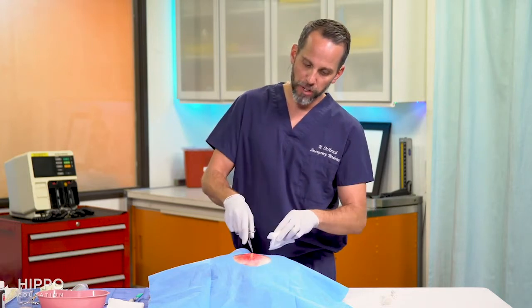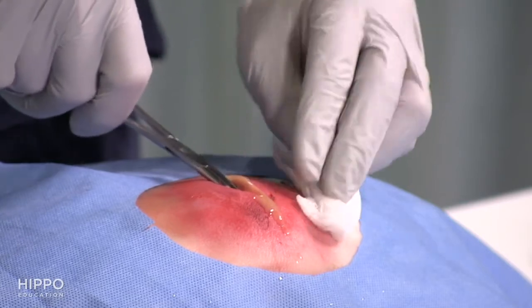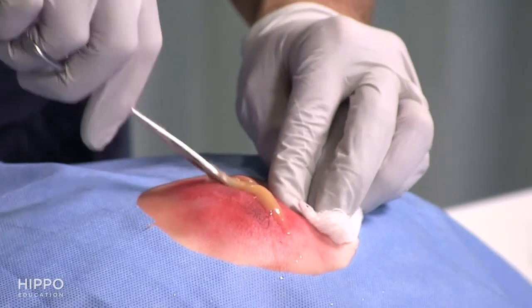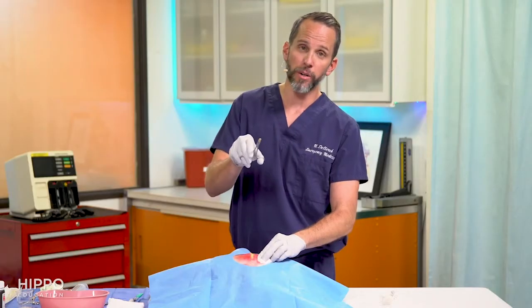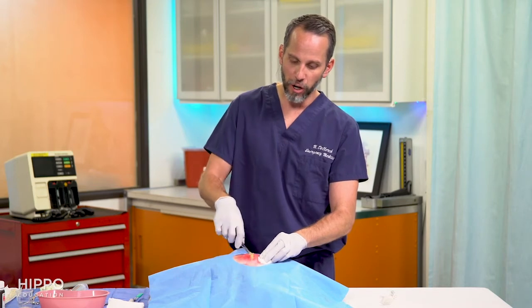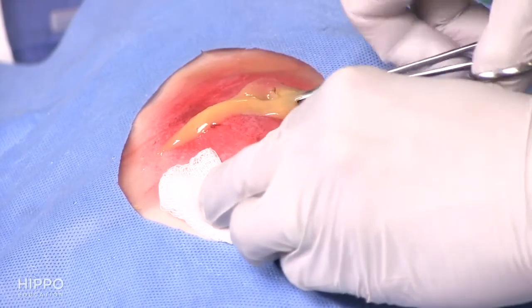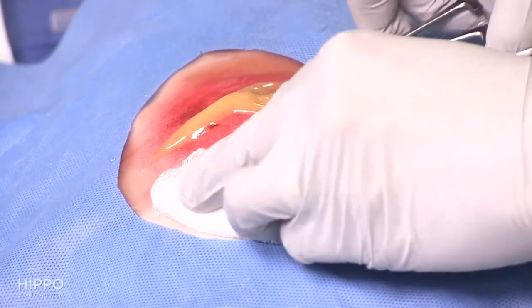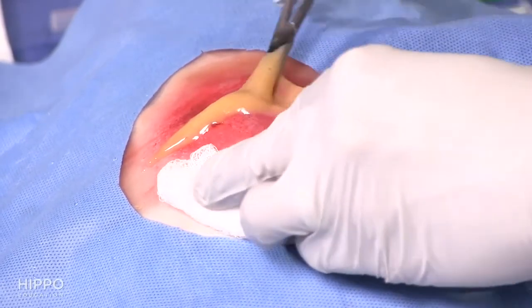You're taking your blunt forceps and you're going into that abscess, and you basically bluntly dissect and you're opening. And by blunt dissection, I mean you're going in and opening, and you're breaking up all the loculations that are inside that abscess, being sure to get all the pockets of pus. This is an especially juicy one. Looks kind of like butterscotch pudding, which is one of my favorite flavors.